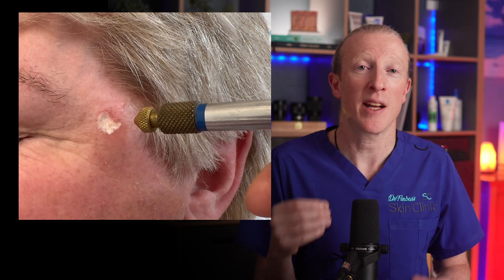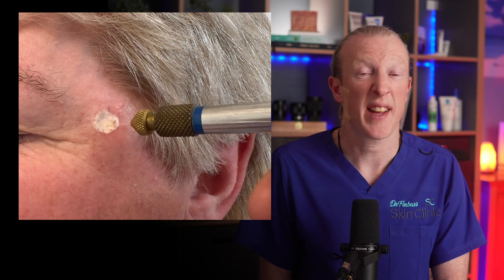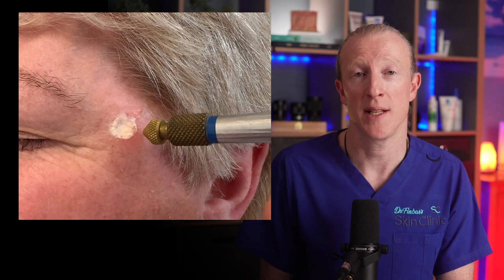The frozen skin goes white, then thaws, and the usual treatment is repeated a couple of times depending on the thickness and type of the lesion — and that's where a bit of experience from your healthcare provider comes into play. Different lesions will require different amounts. I advise my patients that the burning sensation can last around 15 minutes and you may even get a blister starting almost immediately.